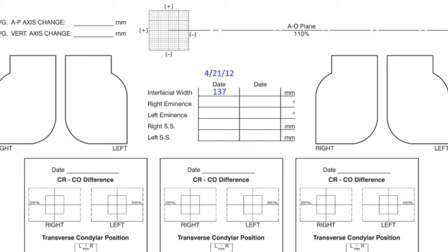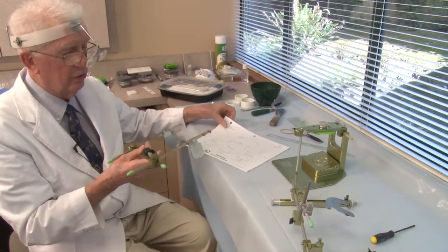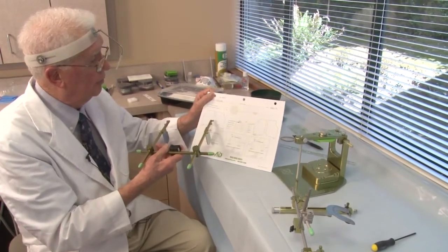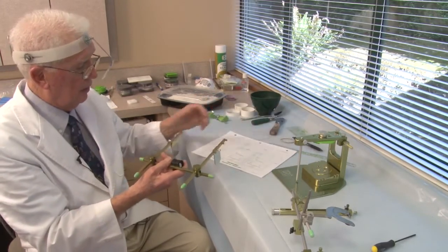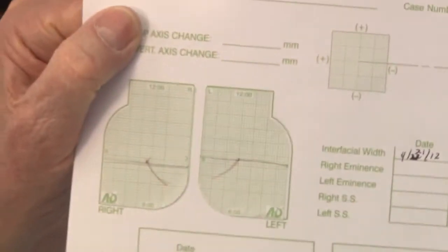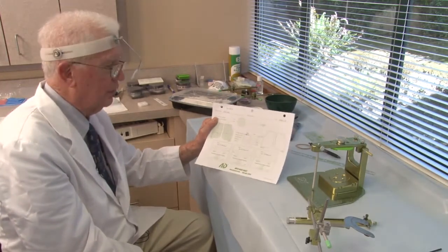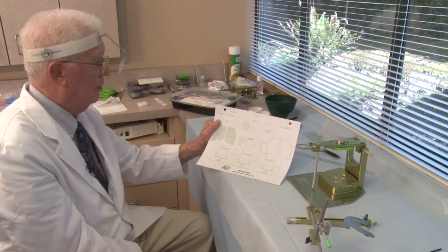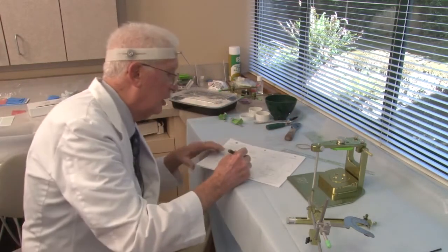And the next thing we want to do, we're going to take the flags, our recording, off and put them on the patient record card, and you can see the place to place the flags. So we'll take the right side off. So we place the patient's flags on the patient record card. You remember that we measured the immediate side shift on both the right and left sides, and the immediate side shift was 1.0 millimeters. So we place that information.